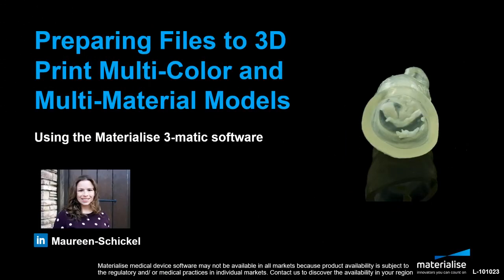Hi, this is Maureen Schickel. This tutorial will cover how to prepare files to 3D print multi-color and multi-material models using Materialize 3-matic.